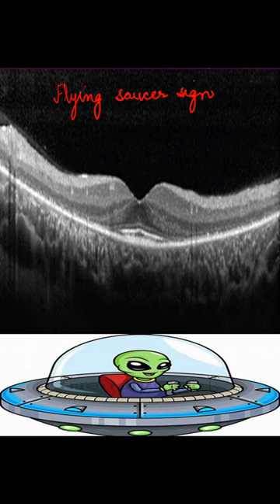This black part is your outer nuclear layer. The outer nuclear layer normally should extend in the entire retina, but here, if you can see, it is present only in the central foveal region. In the periphery, it seems to have been attenuated.